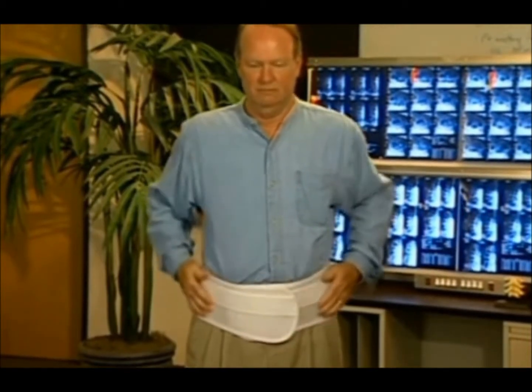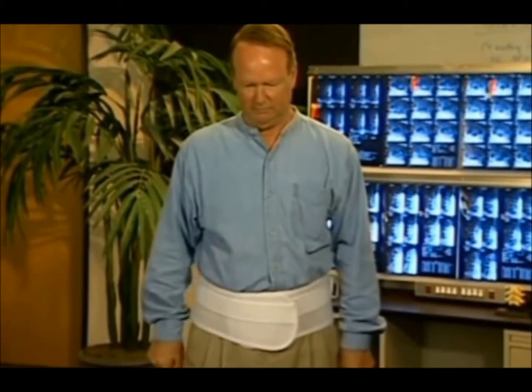The belt should fit comfortably around the lumbar area. Don't place it too high. It should be snug, but not too tight.